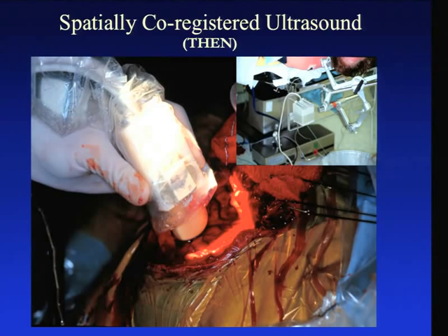Back then, when we first started, we were using an electromagnetic tracker, and here's the thing that sits under the head clamp. I know they're still working on electromagnetic trackers, the great thing being non-line of sight, etc. But we could never get this to work consistently because of the electromagnetic and magnetic, metal environment in the OR. Sometimes it worked great, and we thought, oh, we got it. Then we'd do a case, and it was completely off. It was nice and compact.